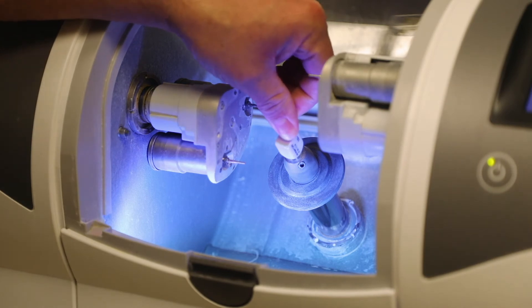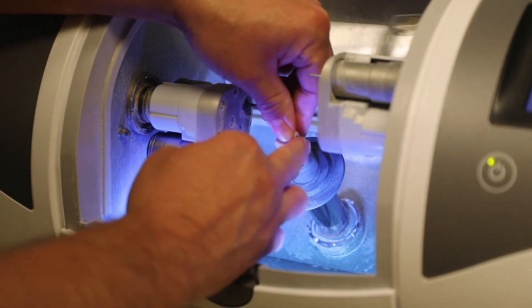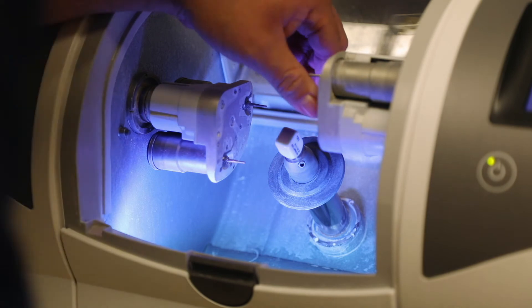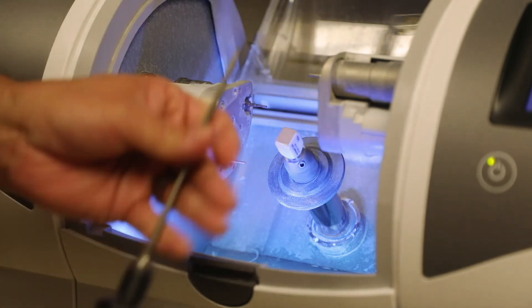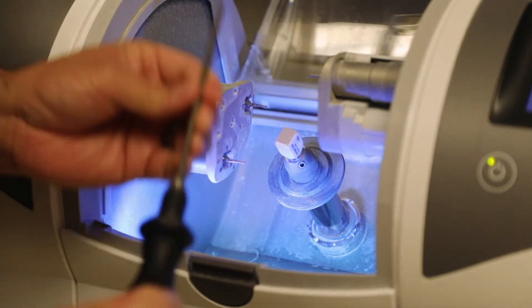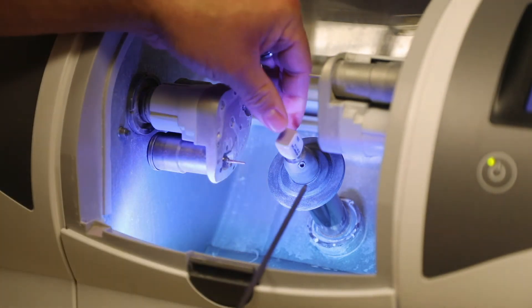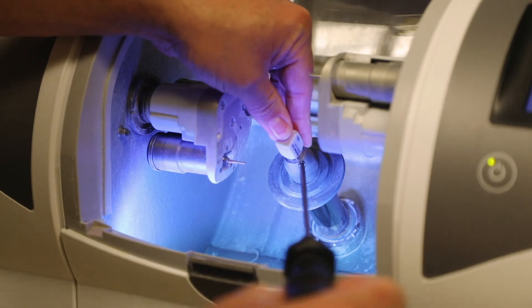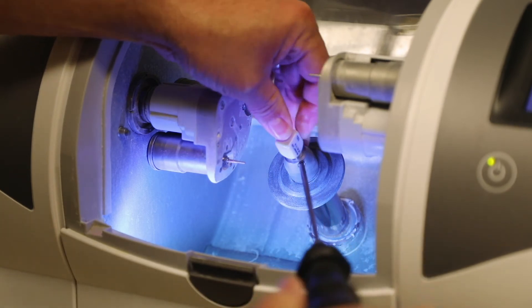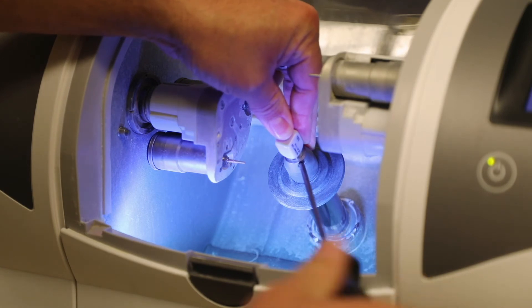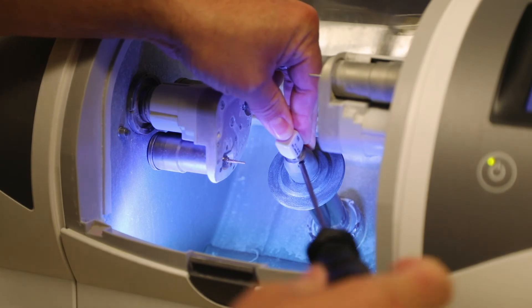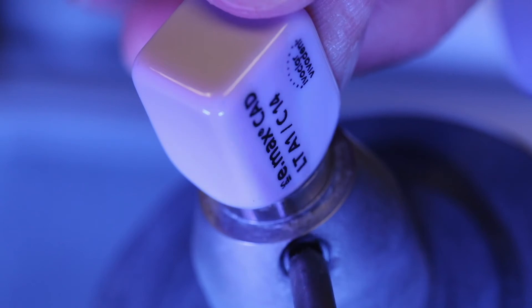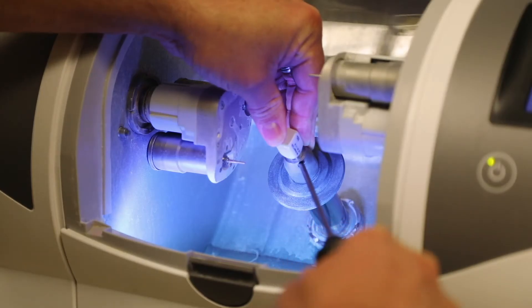What we're going to do is we're going to tighten that into place and secure it. To do that we're going to use the screwdriver system that comes with the milling machine. We're going to insert that here into the screw and we're going to rotate that as we hold the block. We rotate that clockwise.